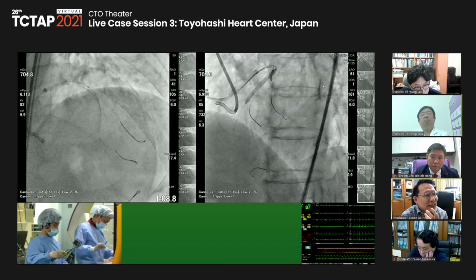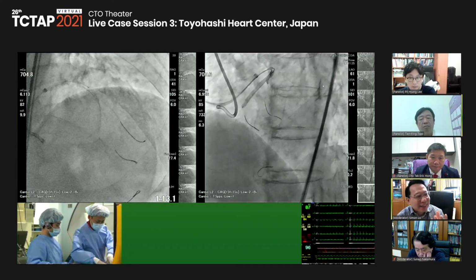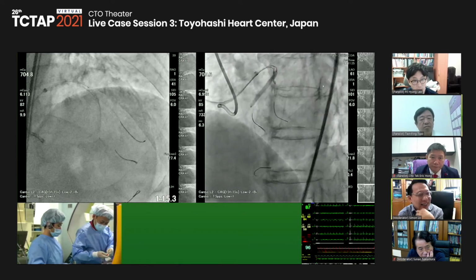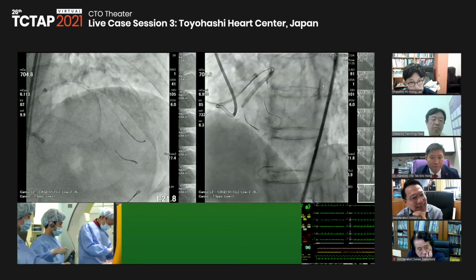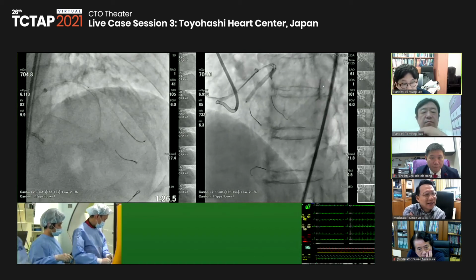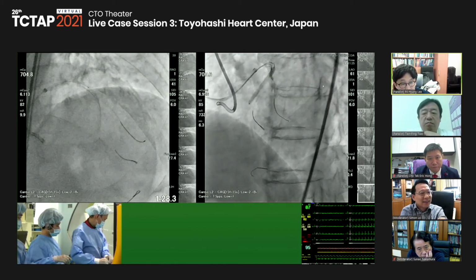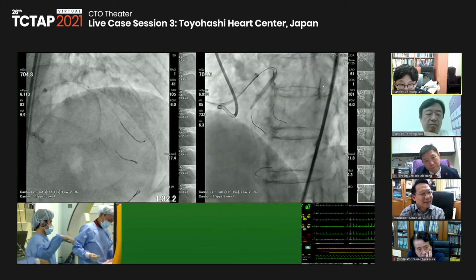I'm interested to see an angiogram now. After you stented it, I'd like to see how the diagonal looks now. Okay, before I dilate, I can show you. Before post dilation, do you do the angio after you do the balloon at the side branch like this?